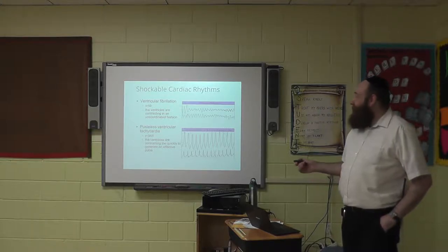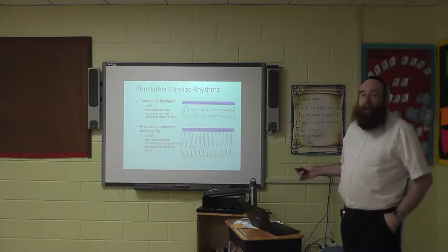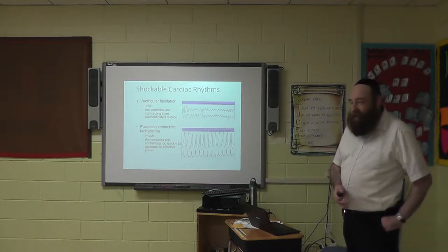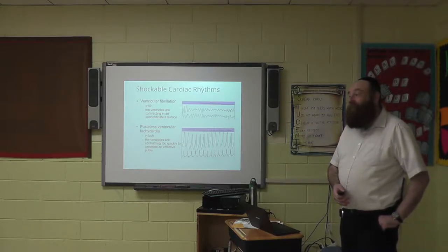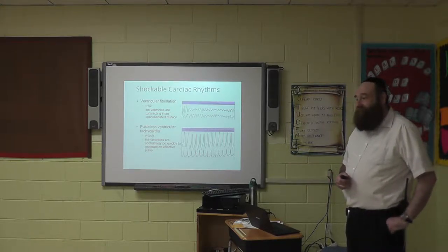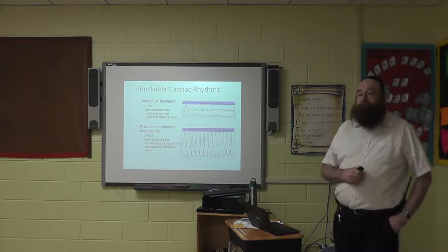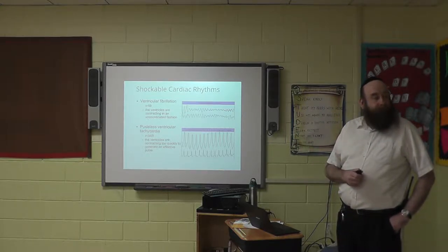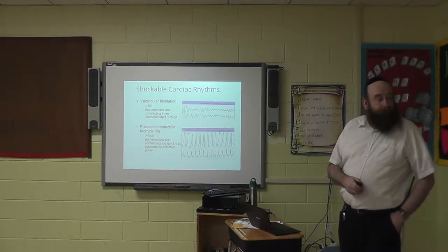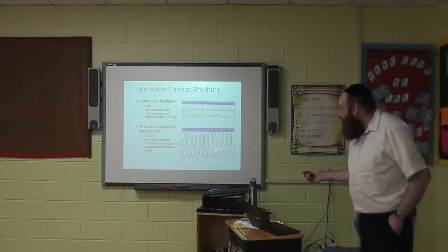So this comes in two flavors. This is VTAC with a pulse or VTAC pulseless. And you only use an AED if they're pulseless. Well, it won't shock if it's not pulseless, no? It'll discover no pulse. Good. It won't shock if it's not pulseless. No, no, it'll shock this. The regular AED that's used by the EMT will shock this.